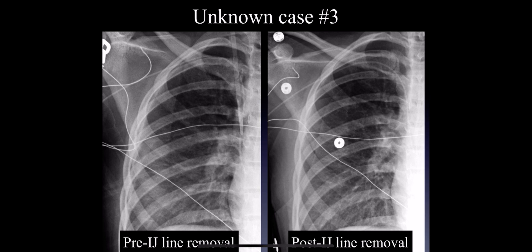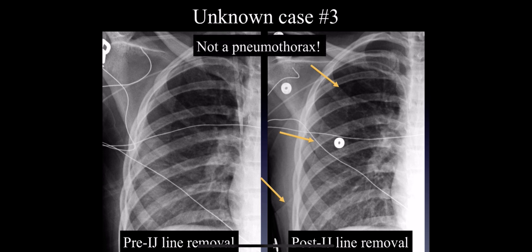Foreign bodies: really force yourself to look for those because they're really easy to miss. Unknown case number three — patient has two X-rays, both before and after internal jugular line removal. The patient developed some shortness of breath right after, the clinical team was concerned and was all ready to put in a chest tube. What you notice is that it kind of looks like a pneumothorax, but if you continue that line inferiorly, it actually extends outside the chest. So this is just a fake-out, something overlying the patient. This is not a pneumothorax — we should not put in a chest tube.